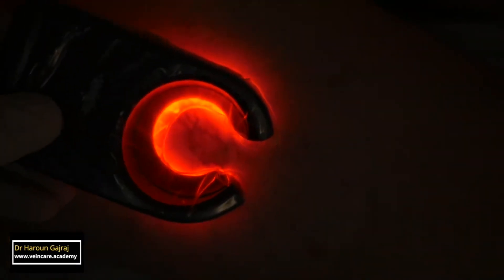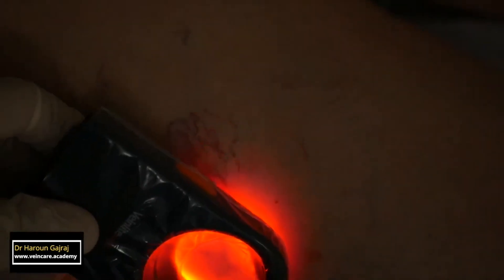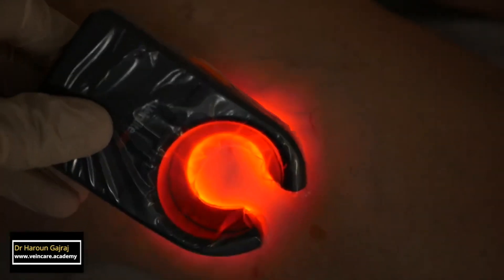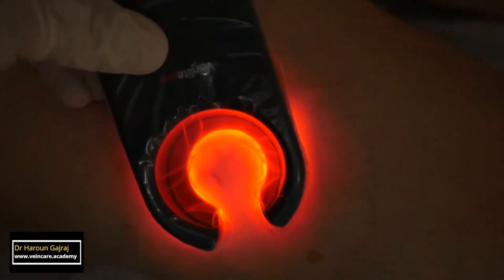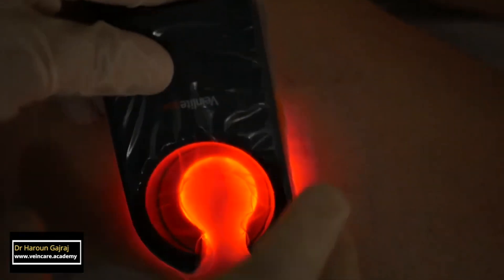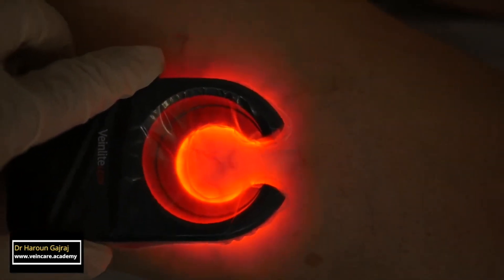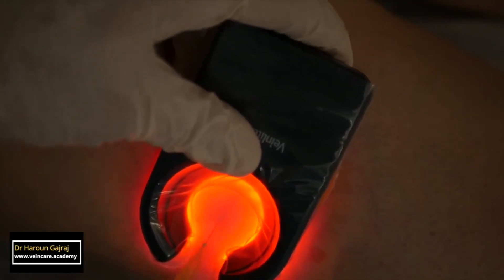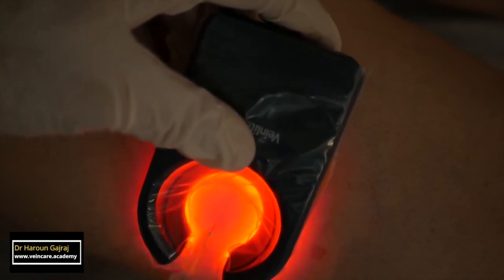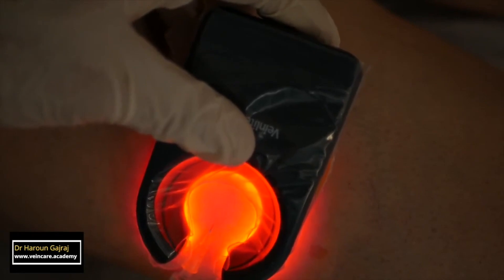Transillumination devices are also useful in some situations. They allow easy visualisation of the deeper feeder veins, as well as providing traction to the skin. Here I'm using the non-dominant hand, illuminating the area with a vein light. I've got a disposable sheath over it to minimise the risks of contamination with blood. I aspirate before injecting into the reticular veins. Reticular veins in association with telangiectasias should be treated — most experts would agree that these feeder veins need to be injected as well.